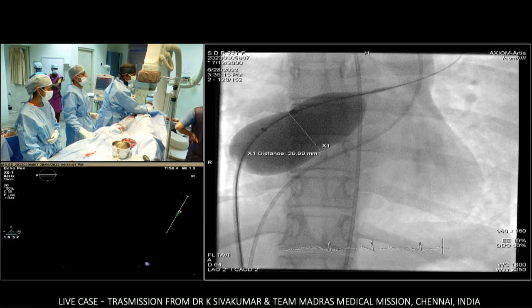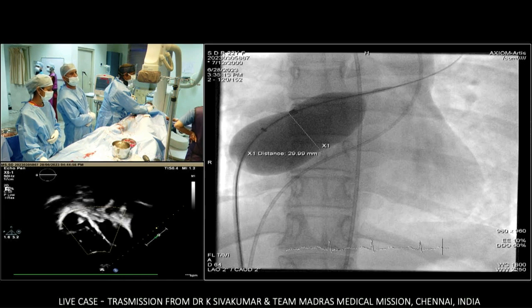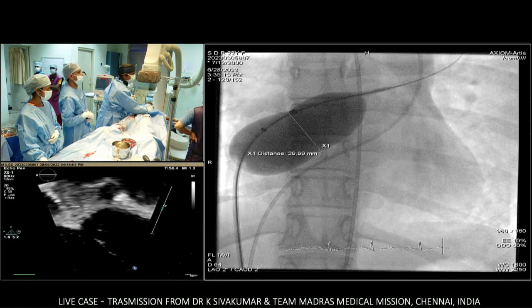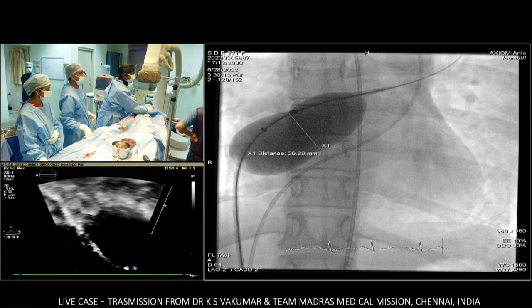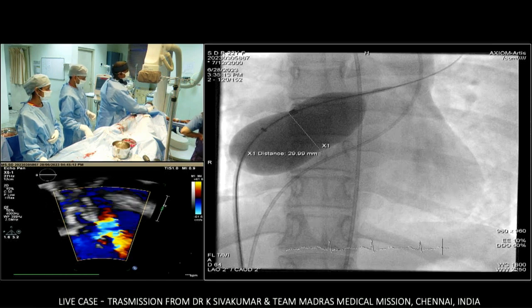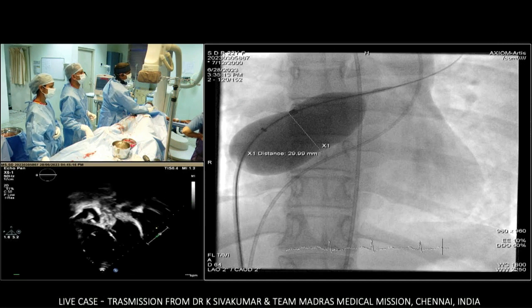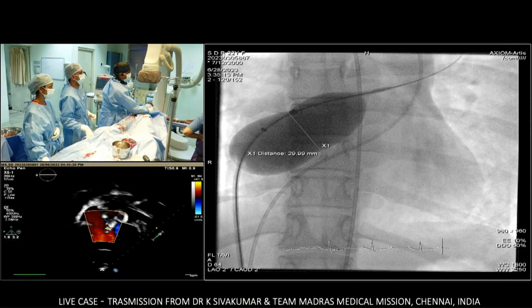Moreover, see now, zoom on the mitral valve, Srija. One by one, zoom on structures. Make the mitral valve alone. Yeah. Show the mitral annulus. How many options of custom-made devices have you got there right now? We have got sizes starting from 26 to 46, 26 millimeters to 46 millimeters.